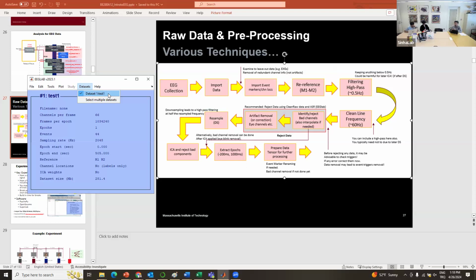Particularly if you change the experimental paradigm, for example, rather than showing clear faces or blurred faces, if you flicker the stimuli, like an image, then it's a good idea to not follow a standard pipeline, but rather try other potential alternatives to make sure that your pre-processing helps your post-processing.